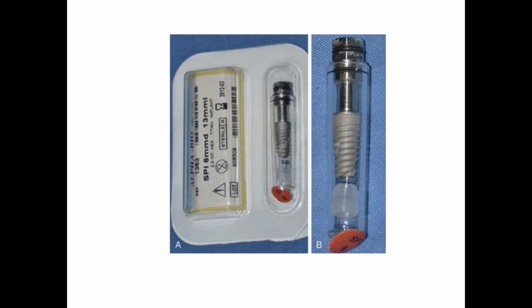The implant is removed from the vial, and avoid touching the sterilized implant surface before inserting it in the bone. The implant is inserted in bone using a ratchet or with the handpiece as we discussed, and of course the cover screw is placed on top of the implant body, and then the flap is repositioned and sutured.